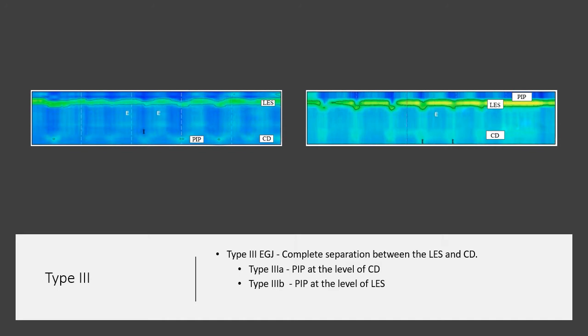In a type 3 esophagogastric junction, there is complete separation between the lower esophageal sphincter and the crural diaphragm. In a type 3a, the pressure inversion point is at the level of the crural diaphragm. In a type 3b, the pressure inversion point is at the lower esophageal sphincter.